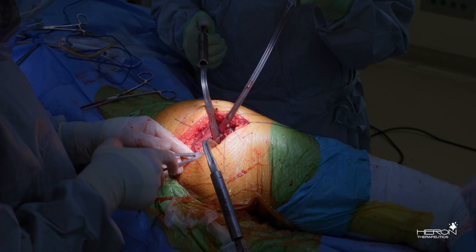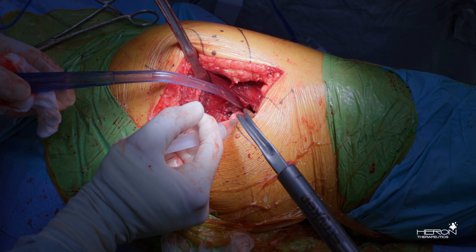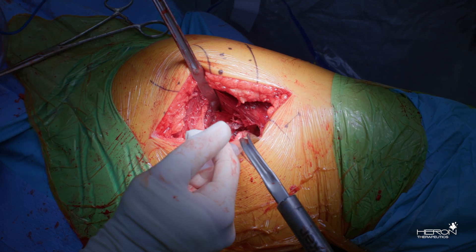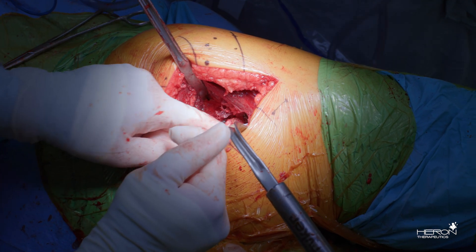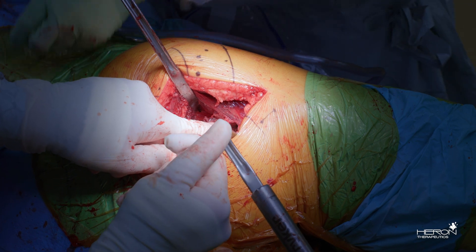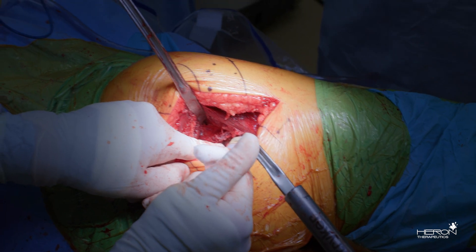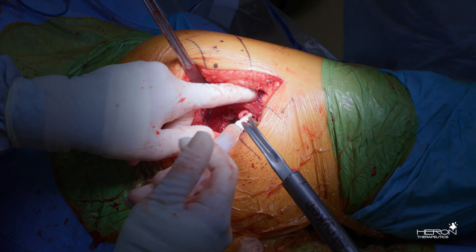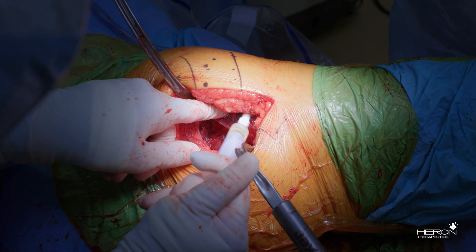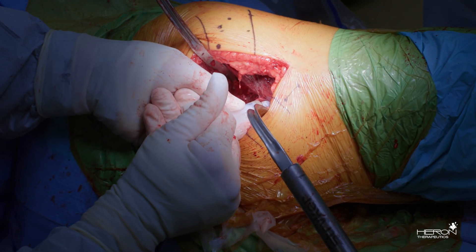Here I'm doing a capsular closure, after which we're going to apply 400 milligrams of the Zen Relief into the wound on top of our capsular closure. We'll make sure we fill up the entire joint space with the solution. We will also apply some underneath our gluteus maximus fascia, which we're doing here prior to closing the fascia. Again, we're going to apply all 400 milligrams in the hip joint before closure.